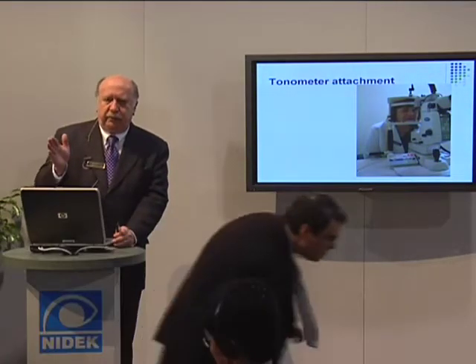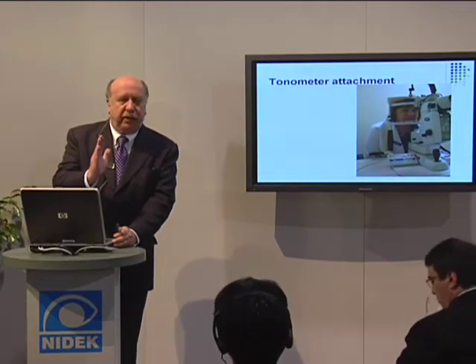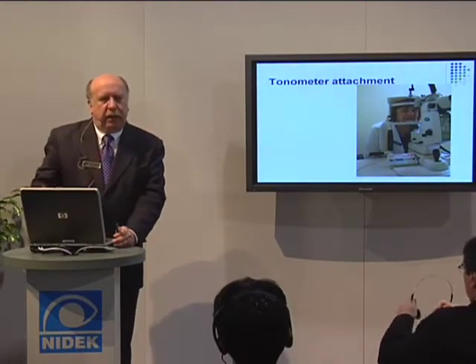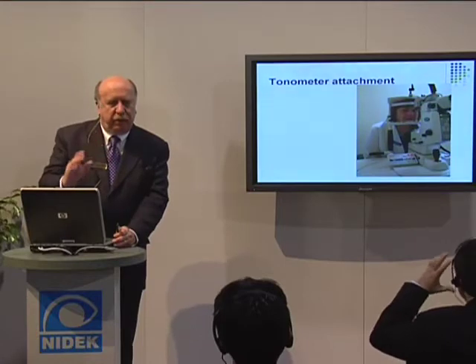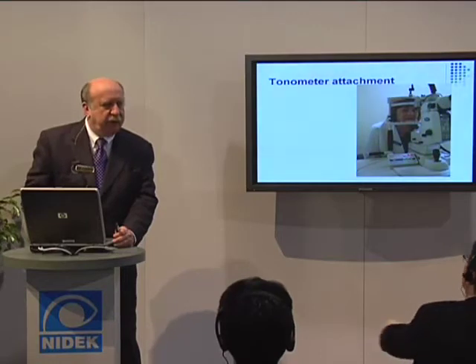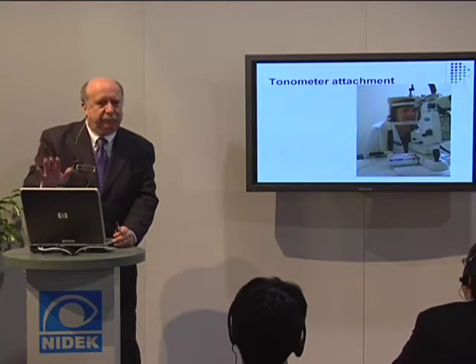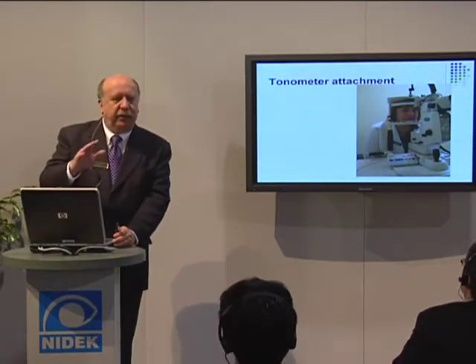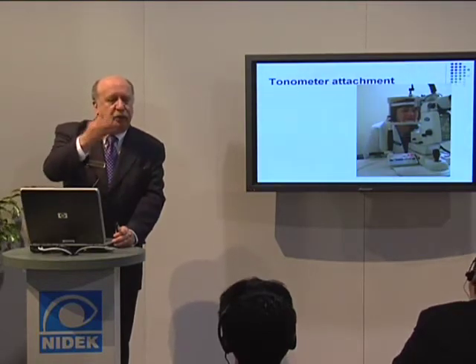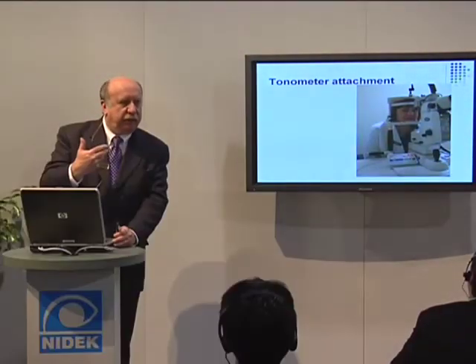The actual system for the Zeiss has a single prism in which the laser and the treatment beam illumination comes through one prism. Now, if you're an ophthalmologist and a user of this combination system, you're most often using a contact lens. Contact lens may be spherical or they may be flat. But with a laser contact lens, if you just look into the laser system with illumination, you get direct illumination back, and what happens? You have a lot of white light coming back at you.